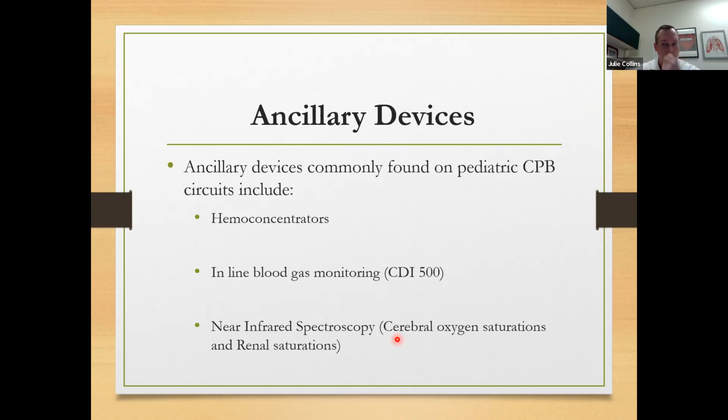But let's say we've checked that, Emil, and the pad's on correctly. Emil was correct in saying at that point, if flow, sweep, temperature, and pad placement have all been ruled out, that's where we're going to increase our hemoglobin. And we talked about on our DO2, in terms of our O2 content, we're going to increase O2 content by increasing our oxygen carrying capacity by giving blood.